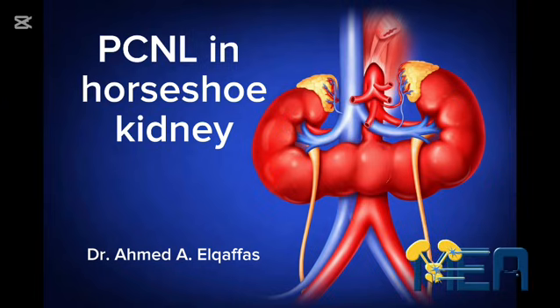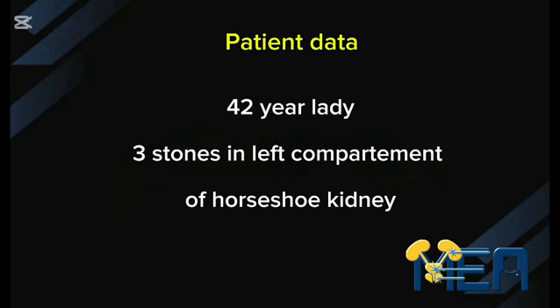PCNL in horseshoe kidney. A 42-year-old lady with 3 stones in the left compartment of a horseshoe kidney.